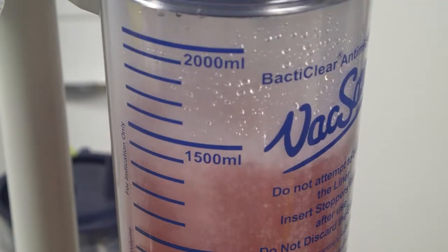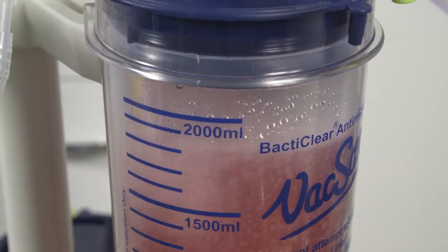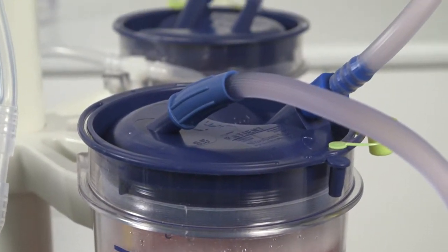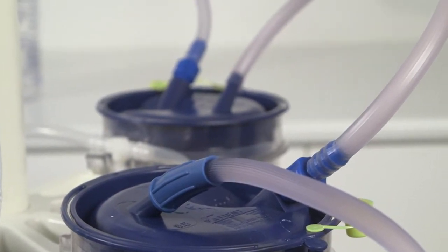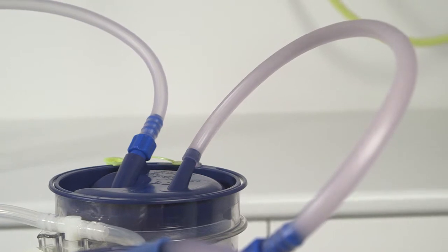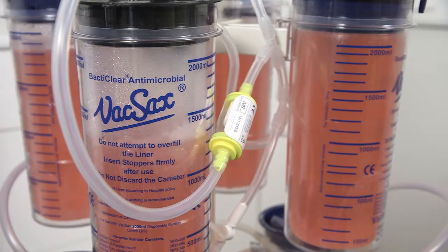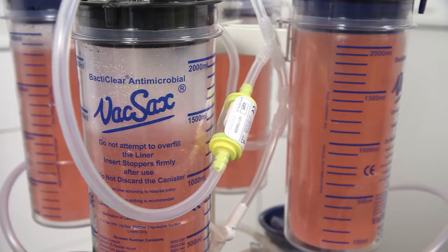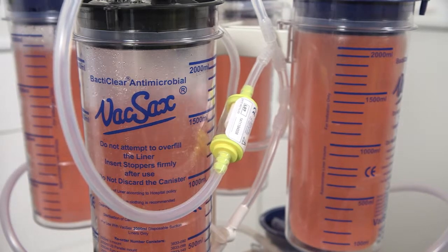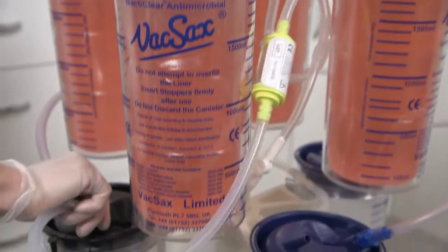Attach the patient tubing to the last blue liner on the top row of four. The system is now ready to operate. When the black lid liner fills to around 1800 ml, disconnect the black vacuum connector and locate it into the black lid liner situated beneath it on the bottom row of four canisters.